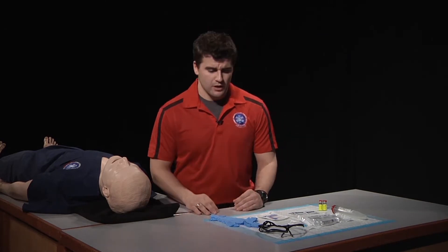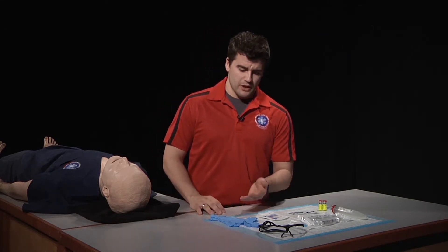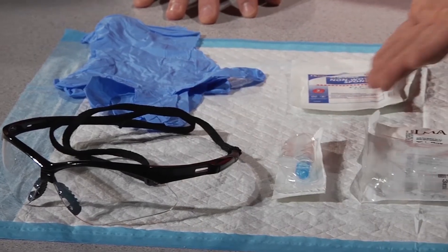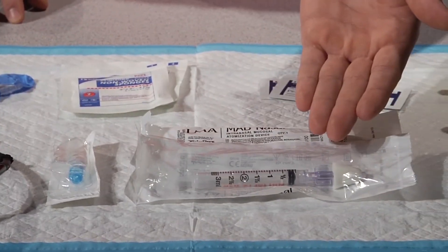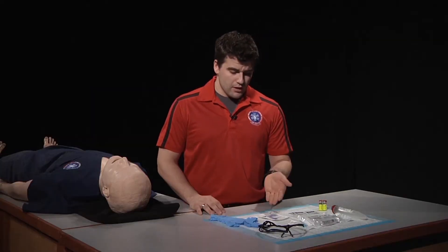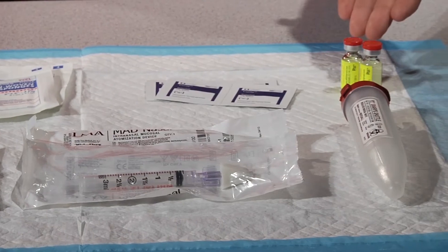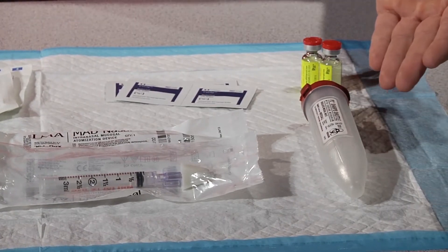From there we're going to set up our equipment. The equipment that we will need for this skill is our PPE, our needle, syringe, and mucosal atomizing device, our sterile gauze, our alcohol swabs, medication, and our sharps container.